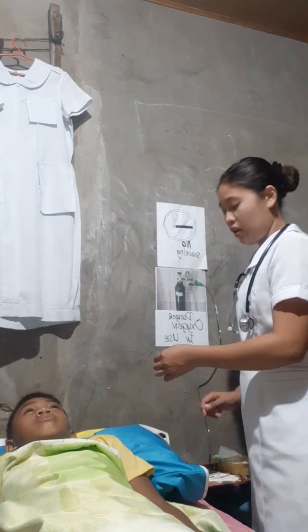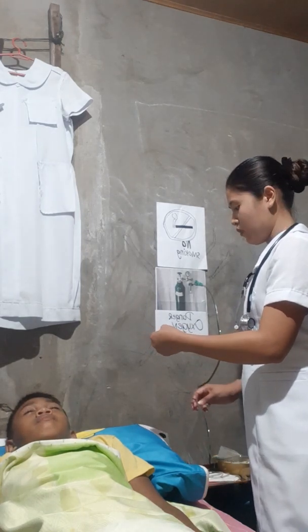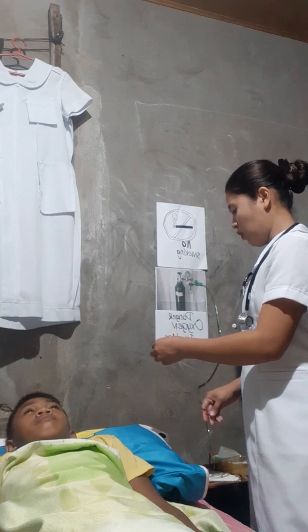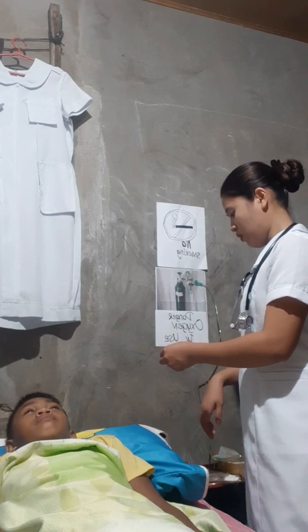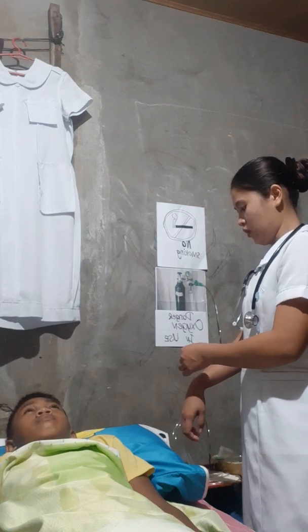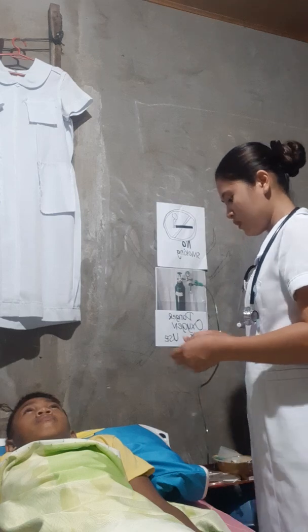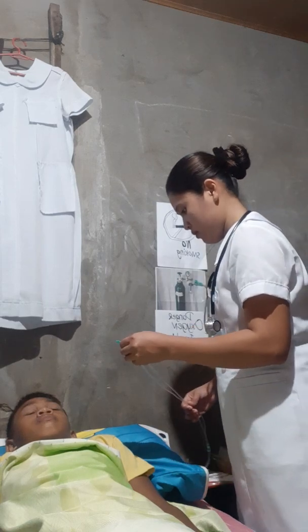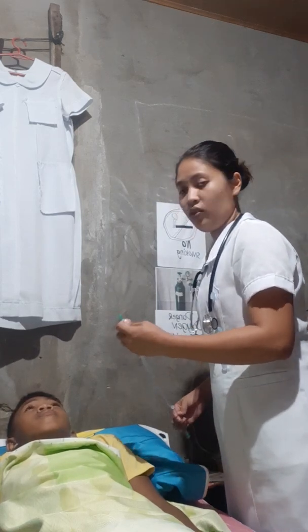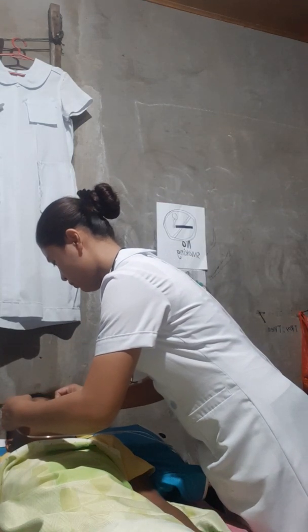Ensure the oxygen is functioning by placing the oxygen tubing on the posterior of the forearm to feel the release of oxygen. Afterwards, place the prongs into the client's nostril.